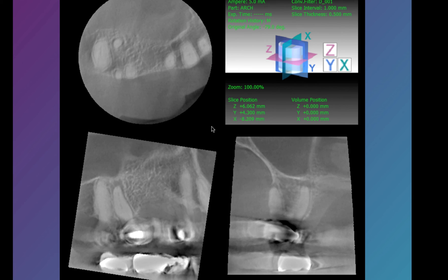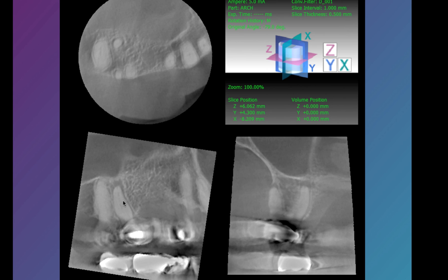Now though, we can take an image and get these different views. In our normal x-ray, all of this bone would have wound up on the shadow on the sensor in the radiograph — showing up white and masking this area of darkness, which indicates a chronic infection around her tooth. With a simple scan of this area, we were able to definitively tell her that yes, she needs a root canal treatment on tooth number three, and that it should be very straightforward. In the old days, she would have gone away with this chronic infection causing more bone loss. This is just one easy way that cone beam CT has changed our practice and allows us to give patients better care.